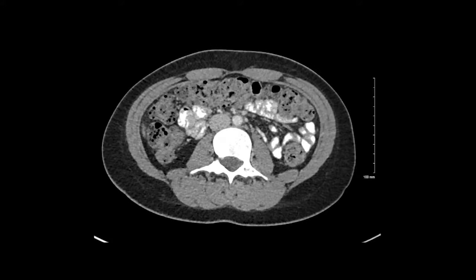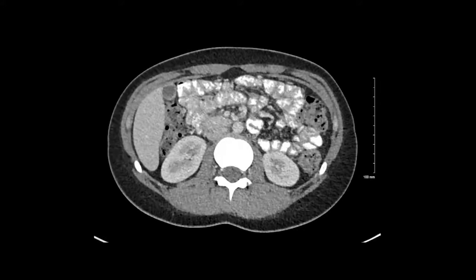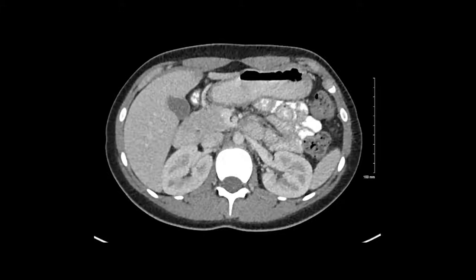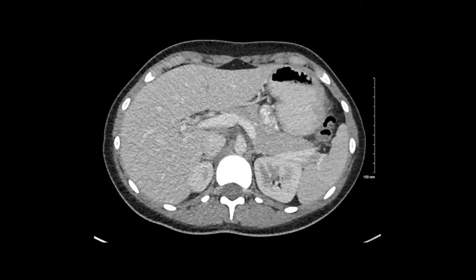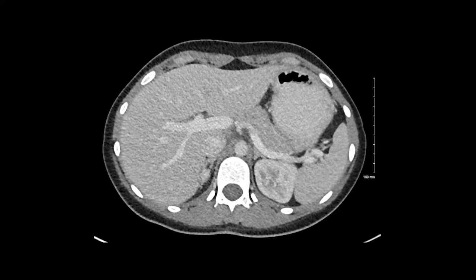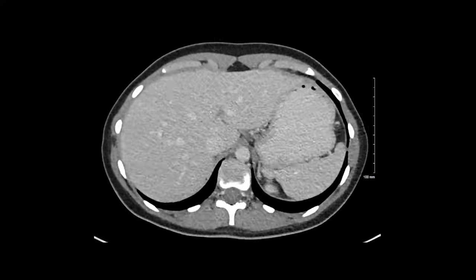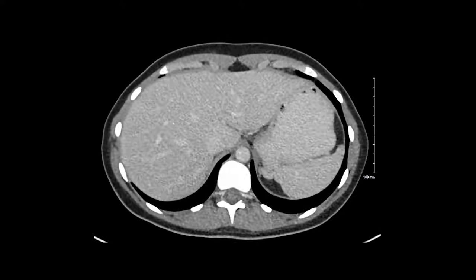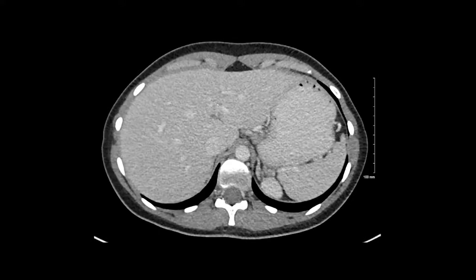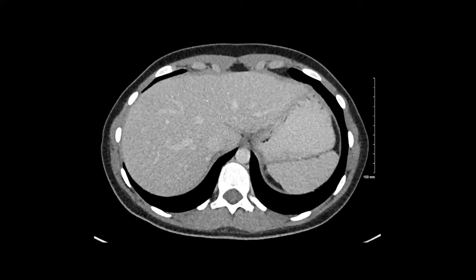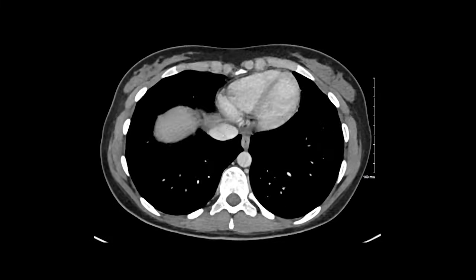Next, we're going to look at the vascular system. Starting with the SMV, I'm going to follow that up to the portosplenic confluence, which sits right about here. Then we've got our splenic vein headed over to the spleen and our portal vein. We don't see any filling defects or other abnormalities. I'm going to look at my hepatic veins — the left, middle, and right hepatic veins — coming together at the IVC.